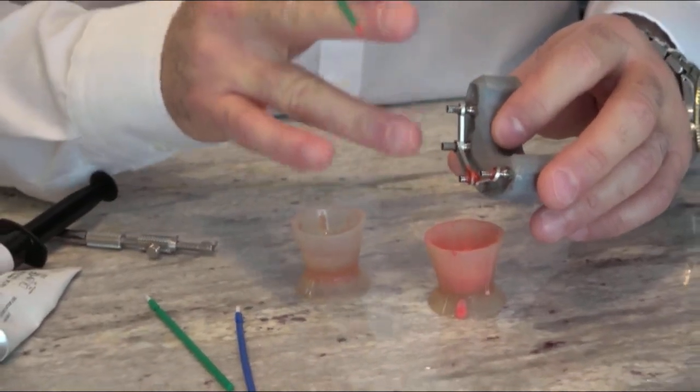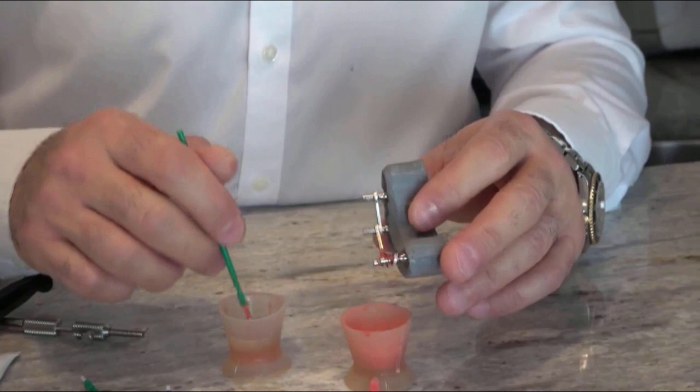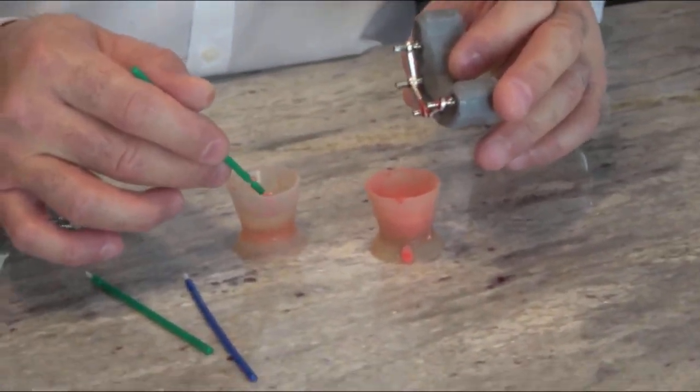What I'm showing you here is exactly what you do in the mouth. This is just a demonstration model to show you how to do it right and what to watch out for, but everything is done to ensure accuracy.